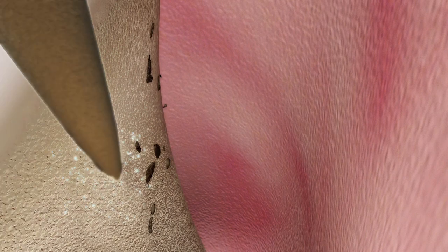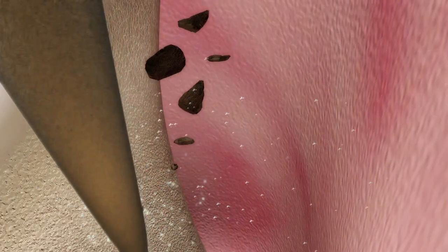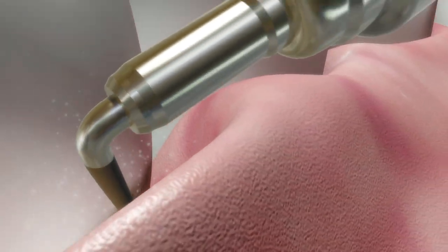Now we go back over the root surface very lightly with a piezo scaler, using a side-to-side motion from the top to the bottom of the pocket just to confirm all the calculus is removed. Thorough removal of the calculus is crucial to good healing results.